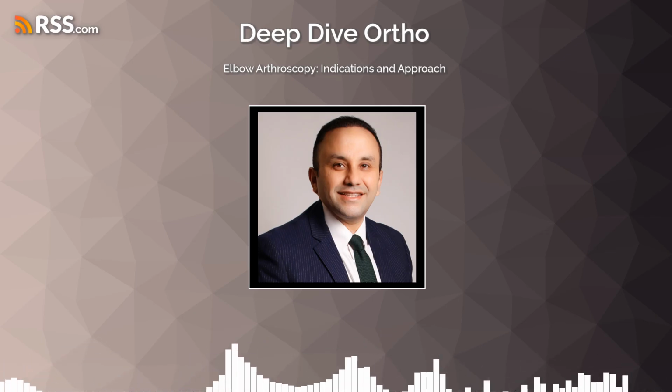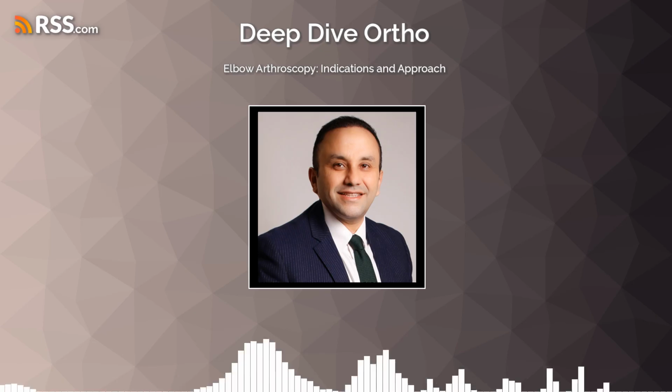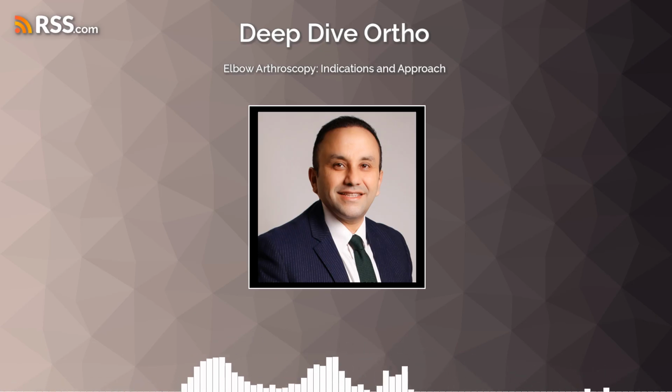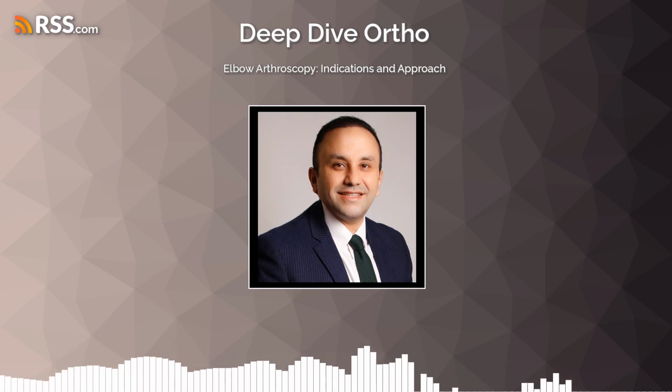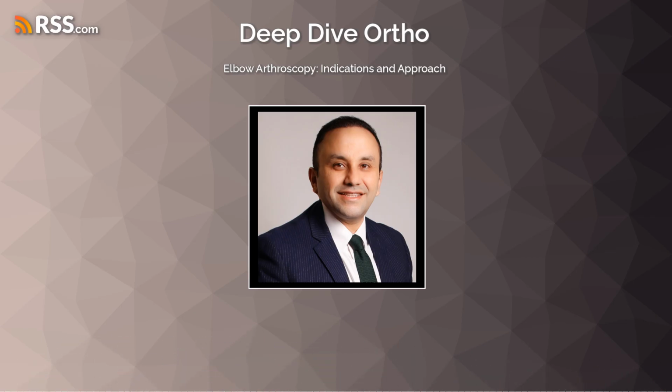So it's not for every fracture, but for specific ones where the benefits of minimally invasive surgery truly outweigh the complexities. What are those core technical principles you apply when you're dealing with a fracture arthroscopically? Precisely. The technique principles involve typically placing the initial arthroscope in a proximal anteromedial portal to visualize lateral structures.